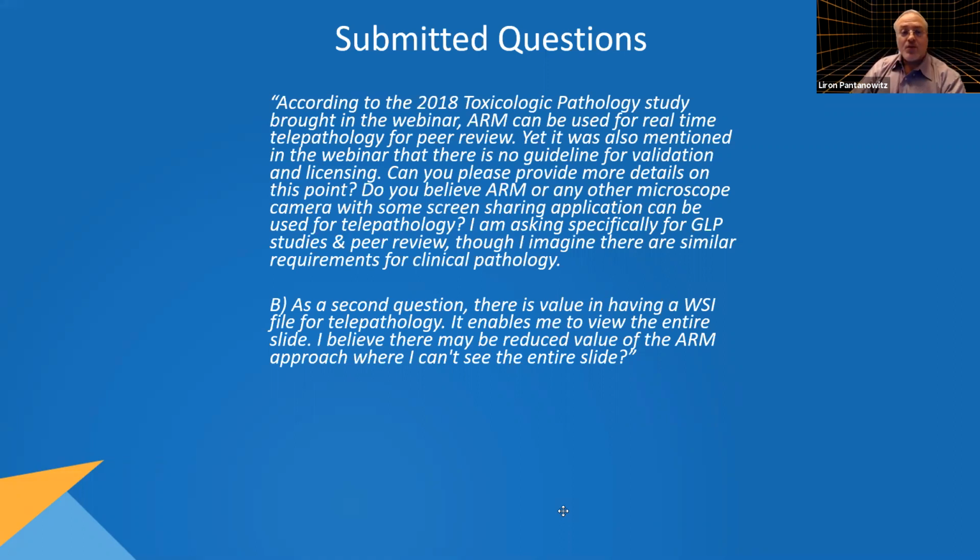But if you have a skilled person on site already, like another pathologist or a technologist, then to buy a whole slide imaging system or a whole robotic system is overkill and unnecessary, kind of what Dan said. Then all you need is, because that skilled person on site is actually doing the heavy lifting, getting to the right area, but they just need some support, a second opinion right there and then, or advice on how to proceed.